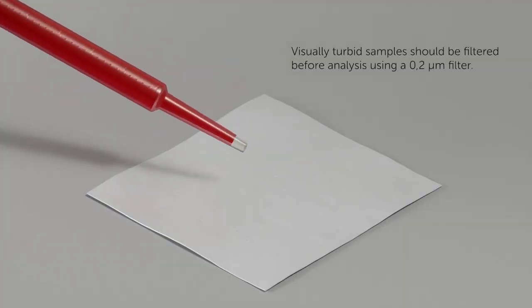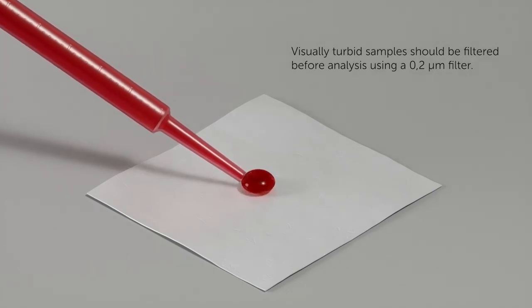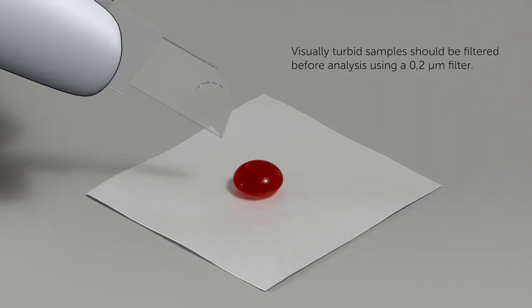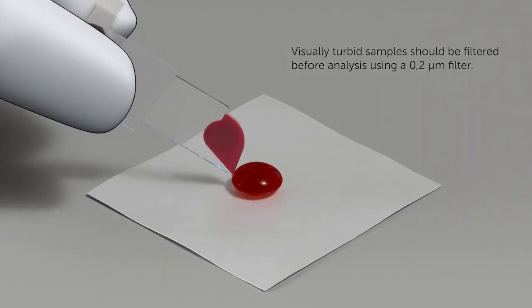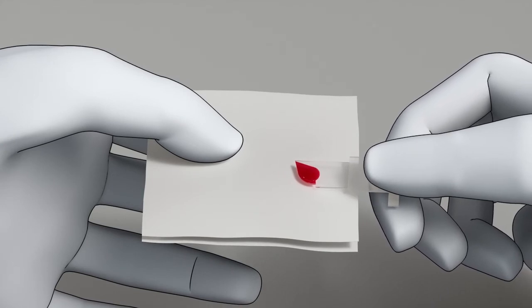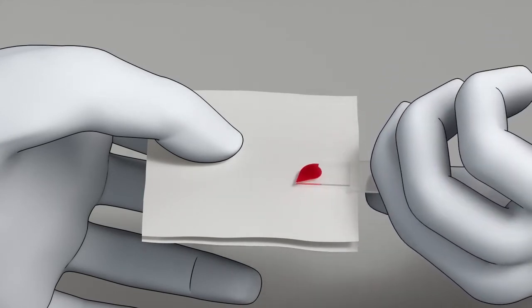Place a drop of well-mixed sample onto a hydrophobic surface using a suitable transfer device. Fill the micro-cuvette completely in one step. Do not refill. Wipe off excess sample from the outside of the micro-cuvette, being careful not to wipe the open cavity.